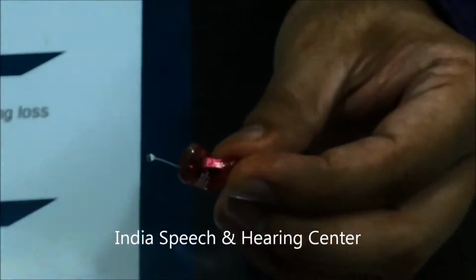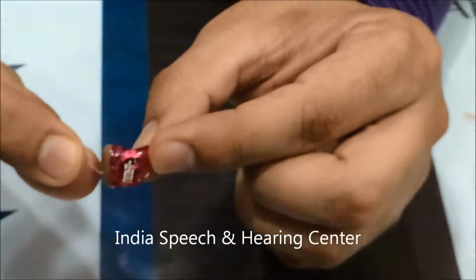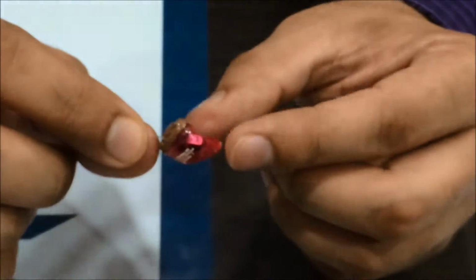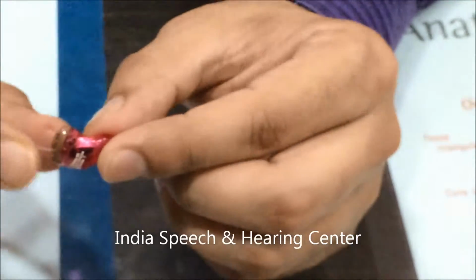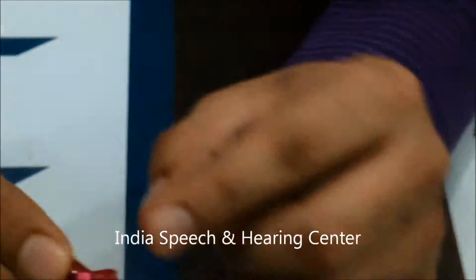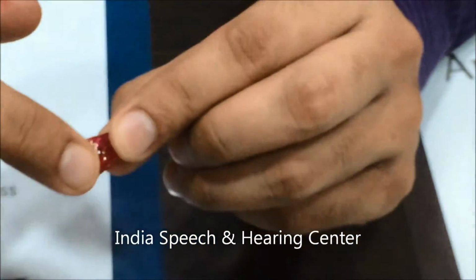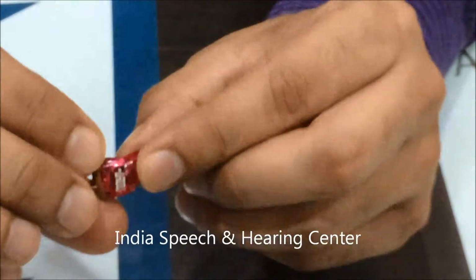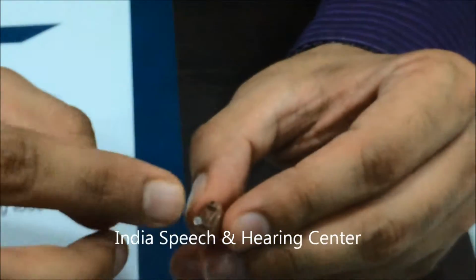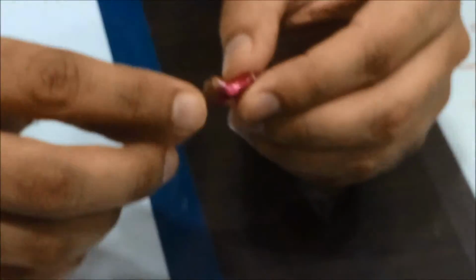Now we'll demonstrate how to put the hearing aid inside the ear. Always remember, if the hearing aid is not inserted properly inside the ear, it will give you a squealing sound, which is the sound of feedback or leakage. In order to insert the hearing aid inside the ear, you have to hold the hearing aid firmly. This end has to go inside. Typically, as per the design of the hearing aid, the part where a written text is there should be outward to the body, and the pulling thread should be downwards. So this is the position in which the hearing aid has to be inserted inside the ear.